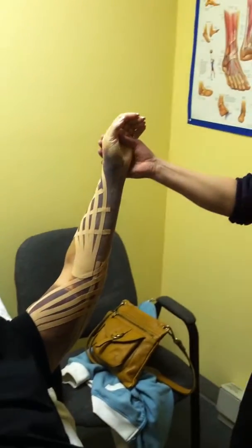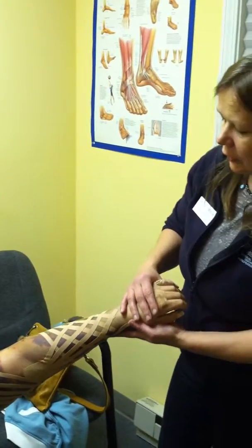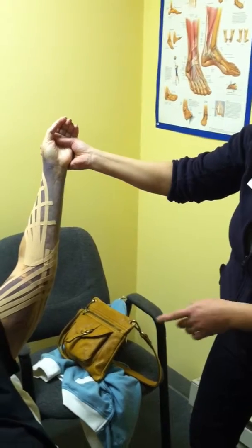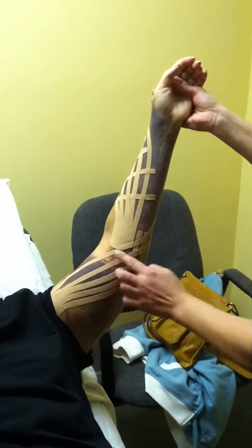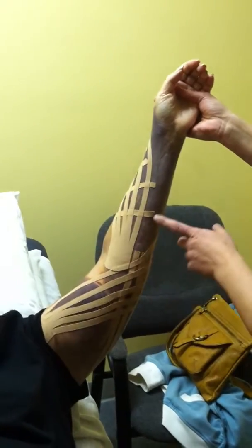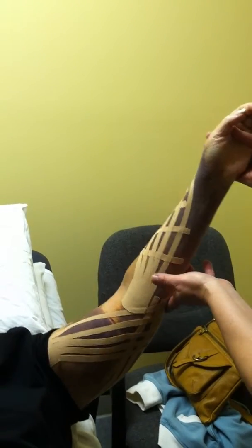So what happened? We have a lot of bruising in here and we need to do the kinesiotaping application. This is a lymphatic training application, so it helps to eliminate these — it helps the lymph to circulate much better and take all this bruising away faster, and recover quicker.